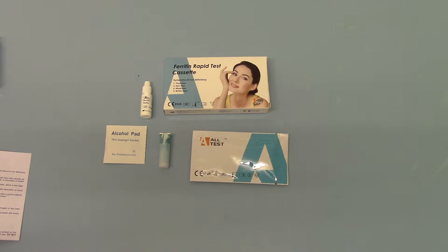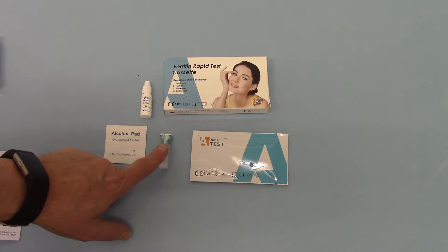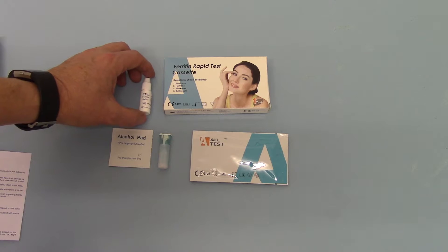Now ferritin is an easy test to undertake. The pack contains a test cassette with a micro pipette, a lancet, an alcohol wipe to wipe your finger and a content buffer.